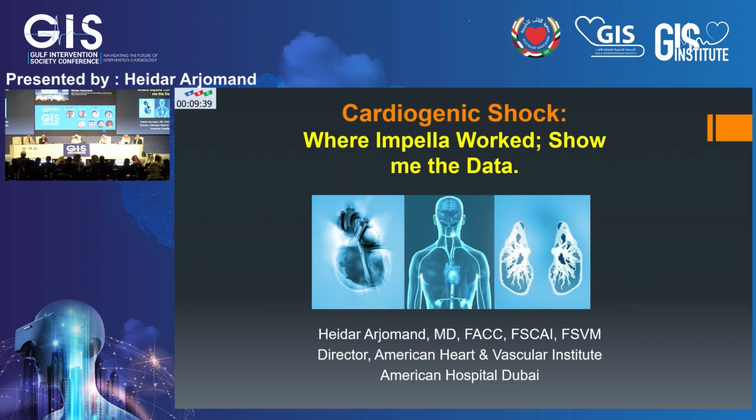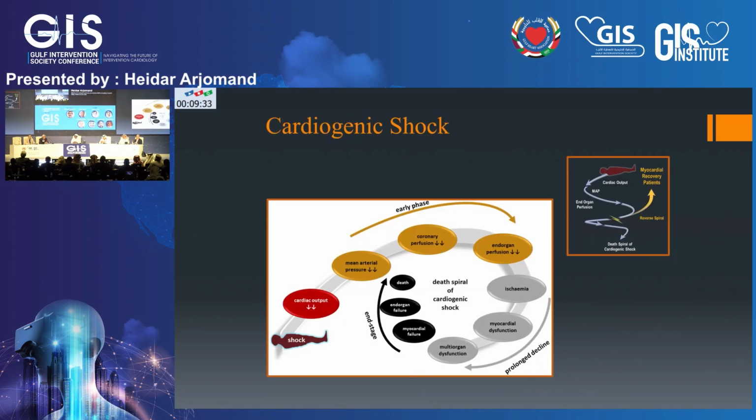So the topic of my presentation is cardiogenic shock, where Impella worked, and what the data is behind it. Obviously, as we know, cardiogenic shock is a syndrome with a broad spectrum. So anytime we talk about cardiogenic shock, we need to make sure that we are on the same page and talking about the same patients, because of the variety of patients embedded in this category.